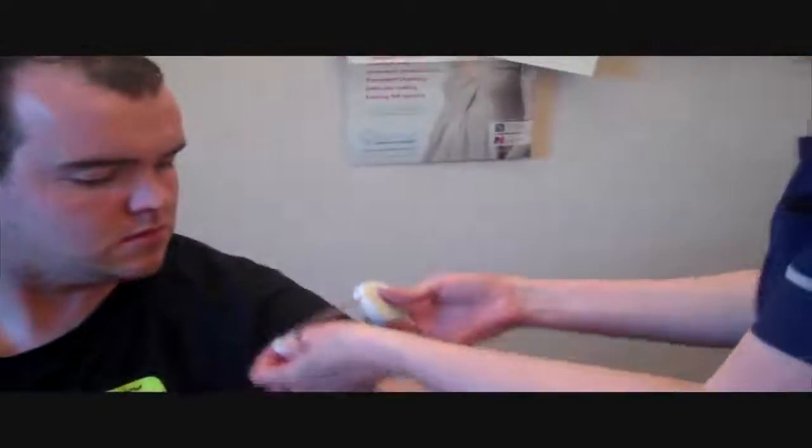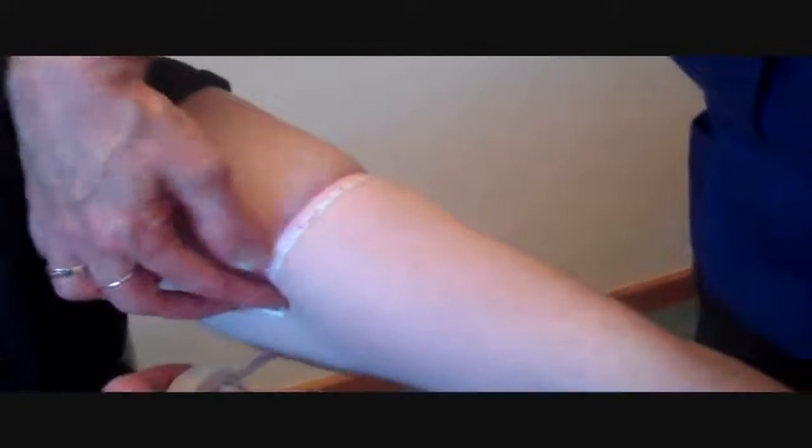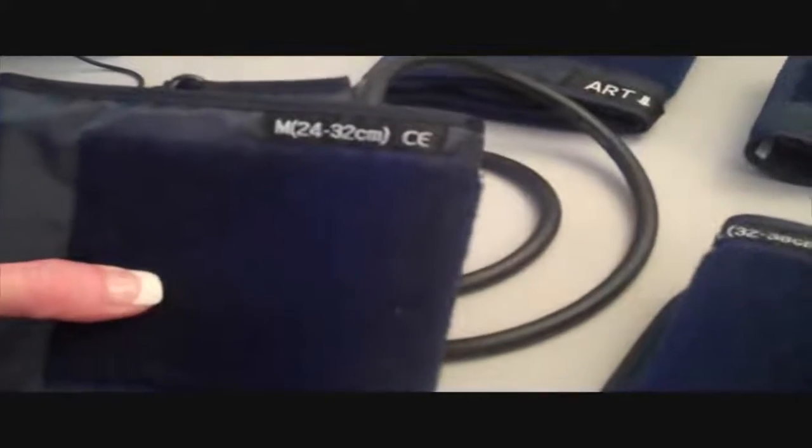I'm just going to measure your arm to see which cuff we need — the most comfortable one for you. Which hand do you write with? So you're dominant on the right, so we're going to put it on the other side, on your left arm. It's 30 centimetres. The cuff we'll choose is the medium one, between 24 and 32 centimetres. And we'll fix it onto your arm now.